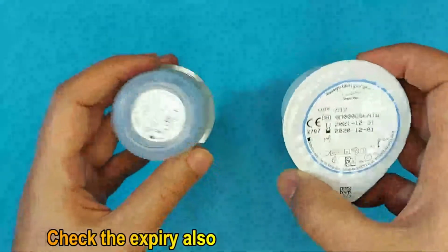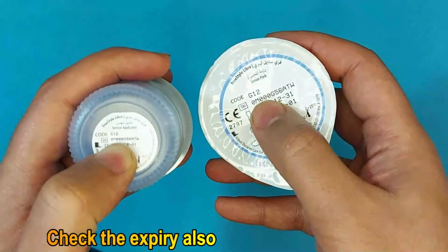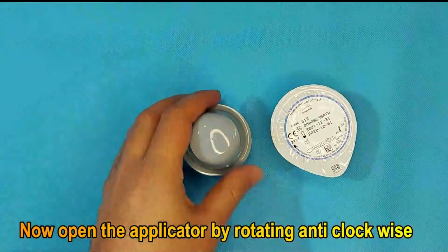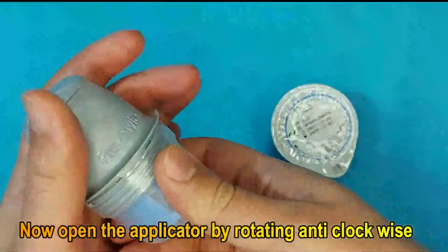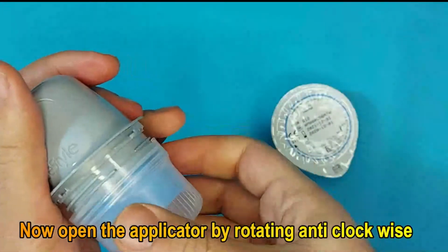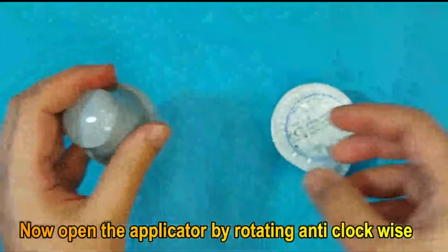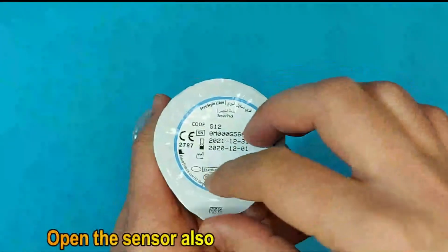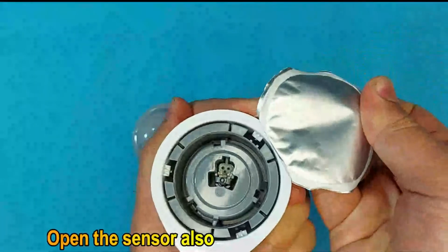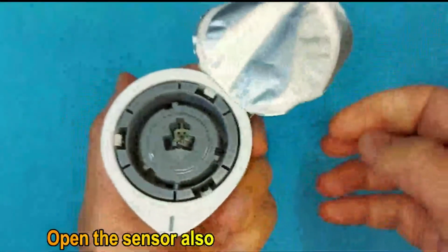Now I will show you how to open the applicator and how to combine the sensor and the applicator. This is the applicator on the left side, as you can see. Now open the applicator by rotating anti-clockwise, as you can see in the video. Open it slowly and gently. As you can see, this is the applicator. Now if you look at the sensor, this is sealed. Remove the plastic or seal from here. As you can see, this is the sensor from inside, as it is visible in this video.